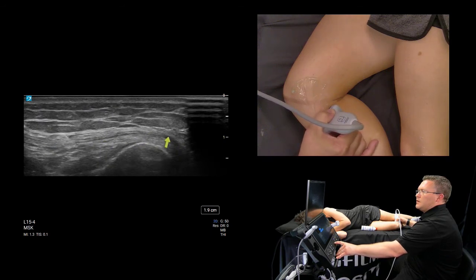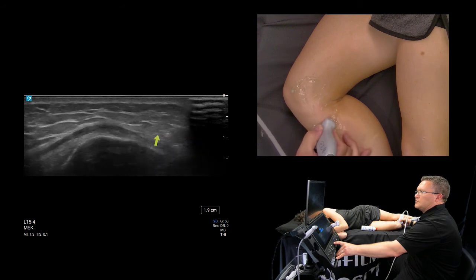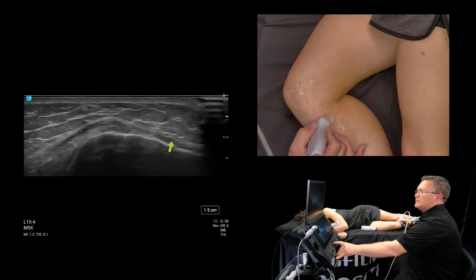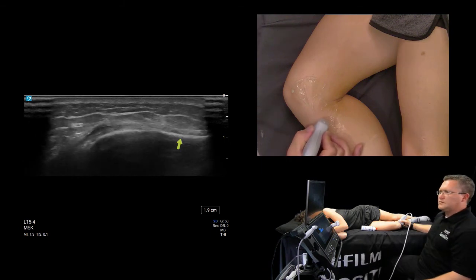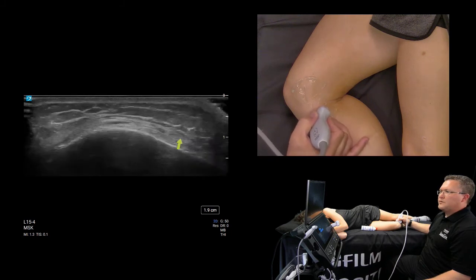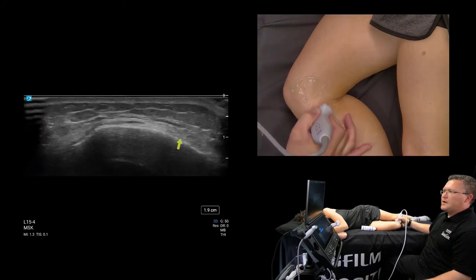So here I'll follow it anteriorly until it tapers very, very thin, mostly sartorius because of its superficial, umbrella-like nature. But here it is, still anterior tibia almost. There I can see the last little segments of its insertion right there. So I do need to constantly remember just how broad of a structure that is. I'm just scanning from proximal to distal, up and down.